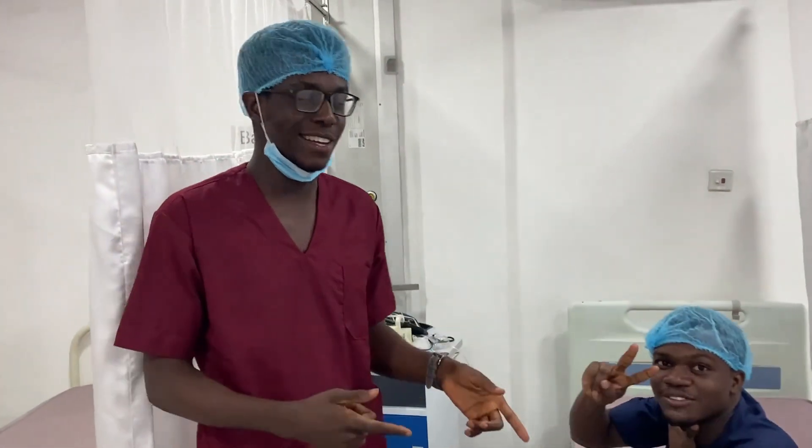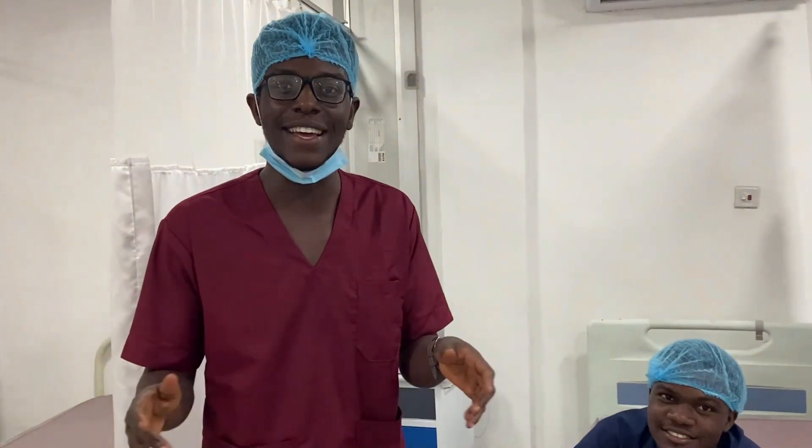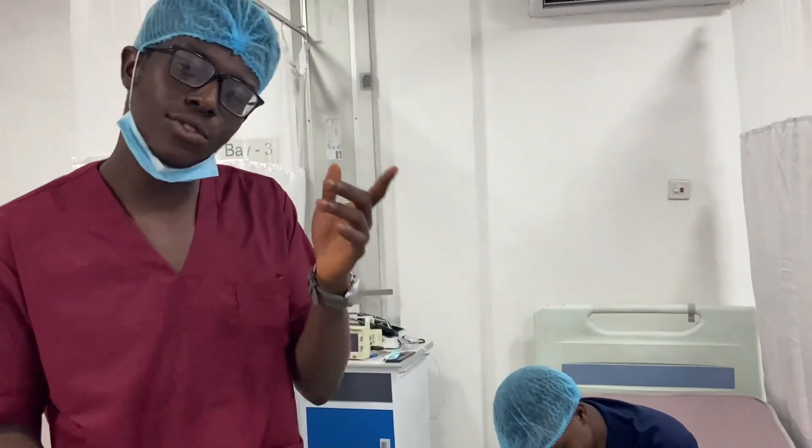Hey guys, it's Christopher. My boy here is going to be my patient today. We are here to do a small procedure for upcoming nurses, and we're going to start with the vital signs procedure.